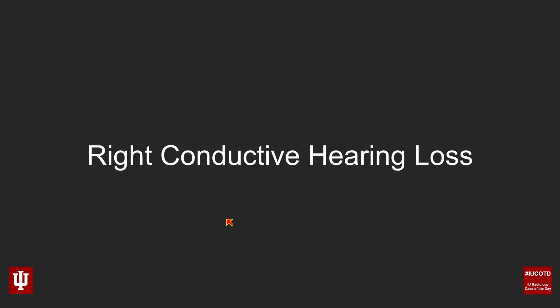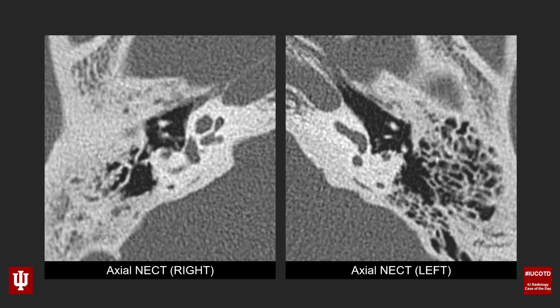The history in this case is a patient who had long-standing right-sided conductive hearing loss. We have two images to look at: the image on screen left is from the patient's right side — an axial non-contrast temporal bone CT — and the image on screen right is from the patient's left, also an axial non-contrast temporal bone CT. Keep in mind that clinical history as you try to figure out what's going on.